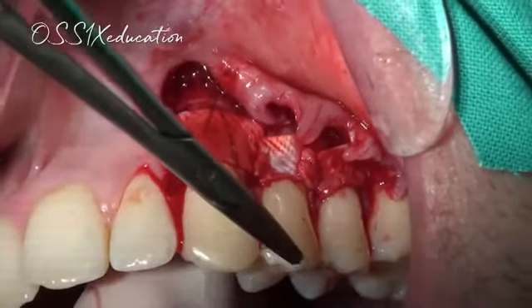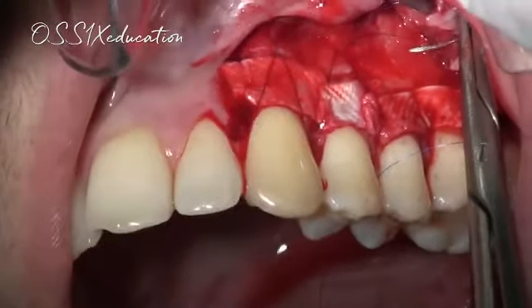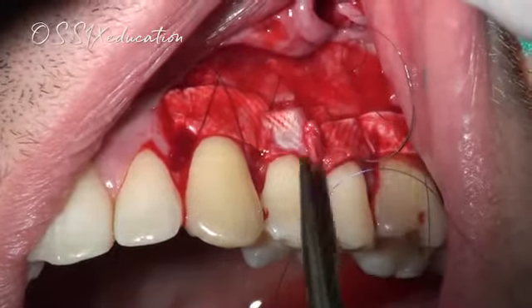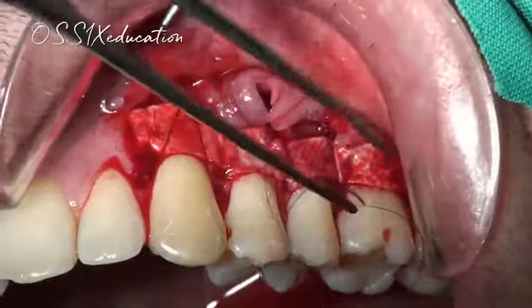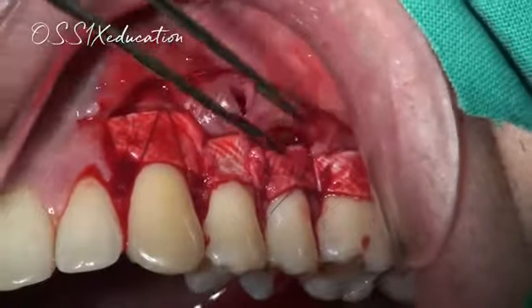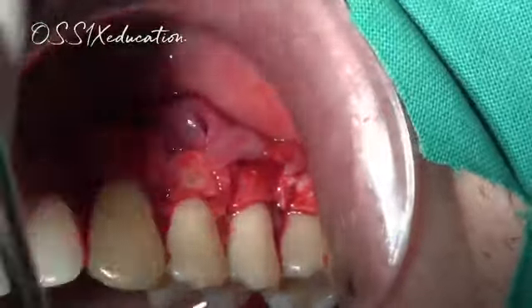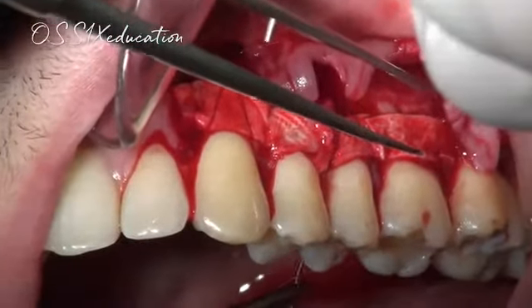Okay, and now we go one by one. You can alternatively choose to do horizontal mattress sutures, but I prefer these crisscross. So you're probably interested how many of these cases I have done over the last almost 3 years. Several hundred. We treated, I would say, at least 100 patients with this indication, and probably another 100 with single recession.